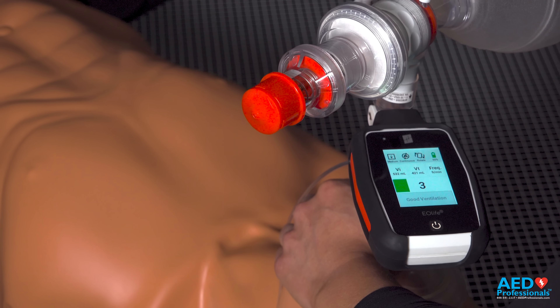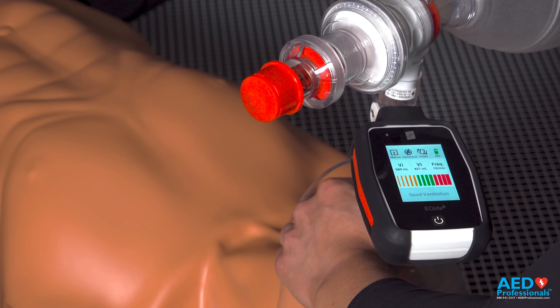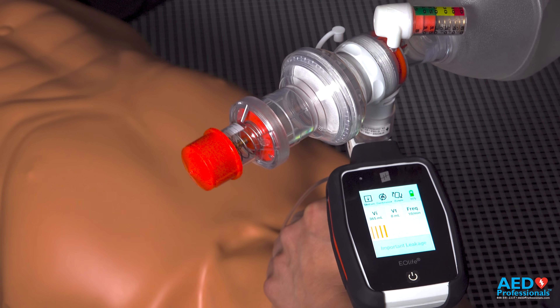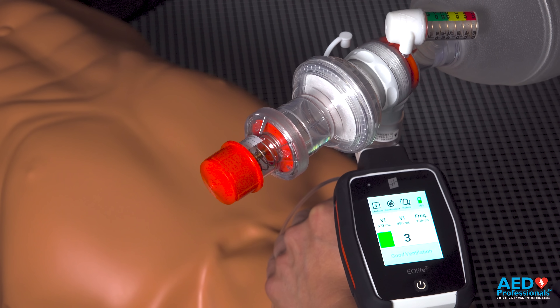Now let's move the mask a little bit to show some leakage. In red, it's showing important leakage, so I'm going to adjust my grip. That felt good — good ventilation.